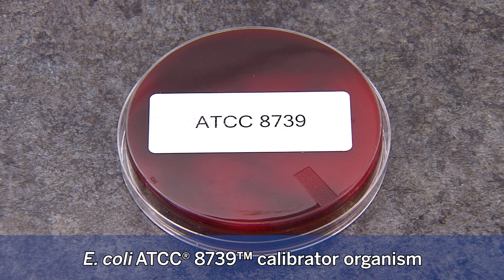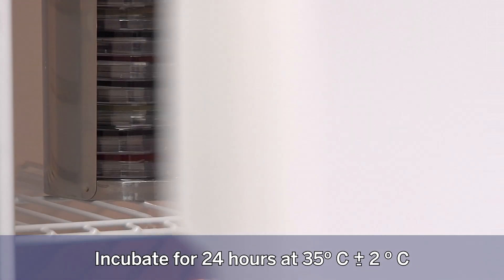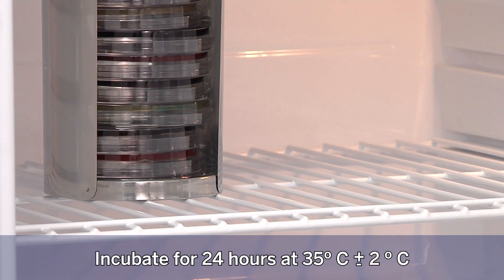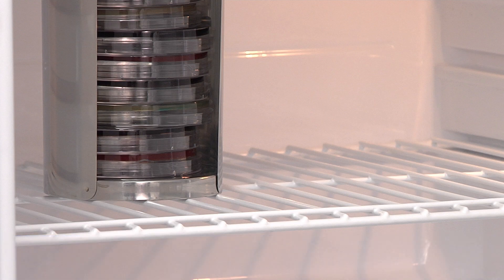E. coli ATCC 8739: reconstitute a purchased stock strain according to the manufacturer's directions. As an example, the Microbiologics package insert details a microorganism maintenance plan. A stock culture plate is inoculated from the reference stock using trypticase soy agar with 5% sheep blood or Columbia agar with 5% sheep blood media. This stock plate is incubated for 24 hours at 35 degrees Celsius plus or minus 2 degrees Celsius and will be used for subculture for four weeks, after which it will be discarded and a new stock plate made from another reference stock culture.